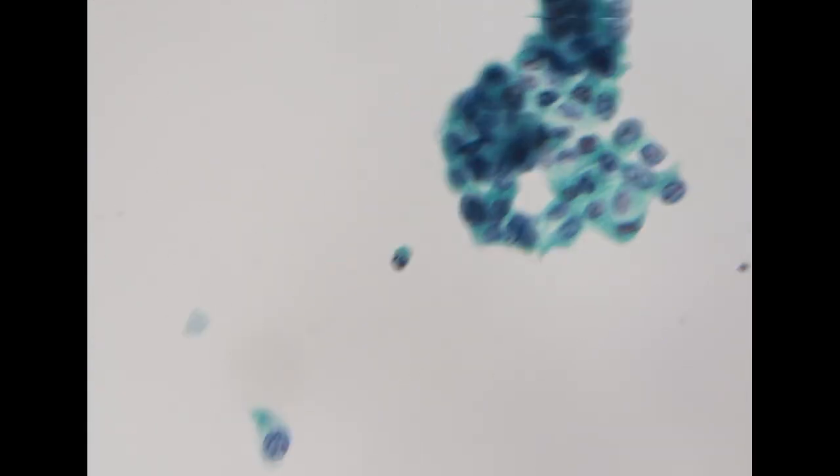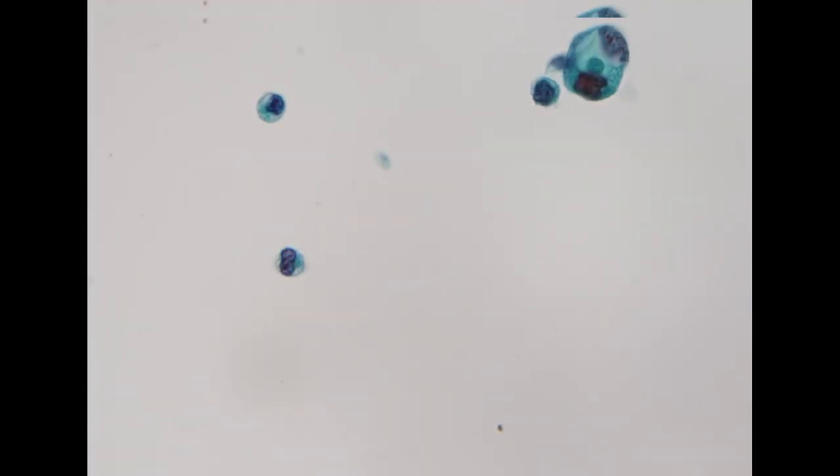So usually in the washing cytology specimen, if you have a lesion, the clinician must see the lesion and flush the lesion to collect the urine specimen, and you will see the majority of the cells are lesional cells. The normal cells will be very, very scant in the washing cytology specimen if it is a positive specimen. So for this case, we will call this positive for high-grade urothelial carcinoma.